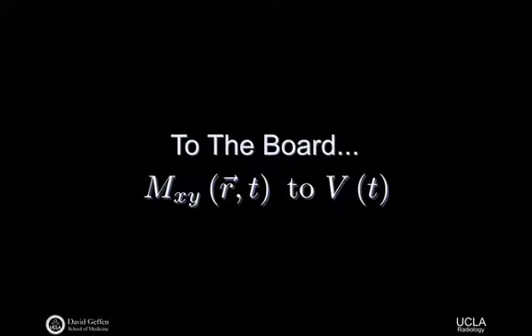Okay. Let me just point out then what we're basically left with at this point, right? We have a B receiver field's X component, and we have a B receiver field's Y component, right? And we know what the dMx/dt term looks like, and we know what the dMy/dt term looks like. So I want to rewrite this last expression just as the product of having taken the partial here. Is that okay? Okay, so to do that, I gotta wipe out some stuff and get started again.